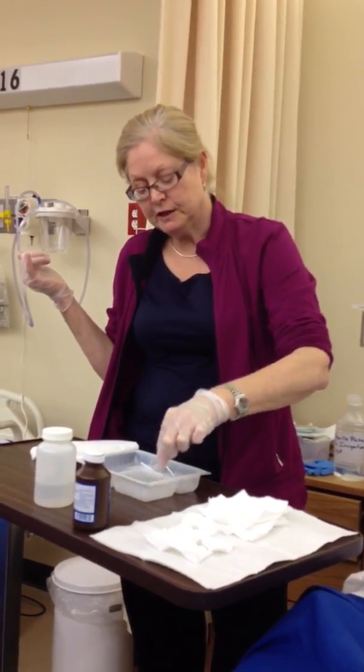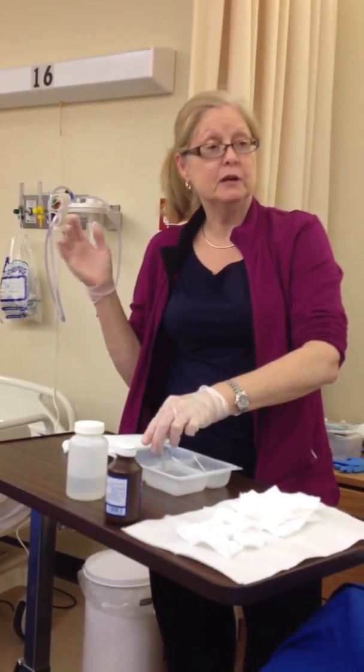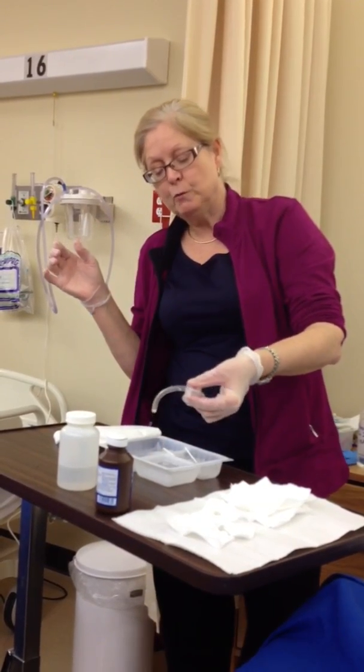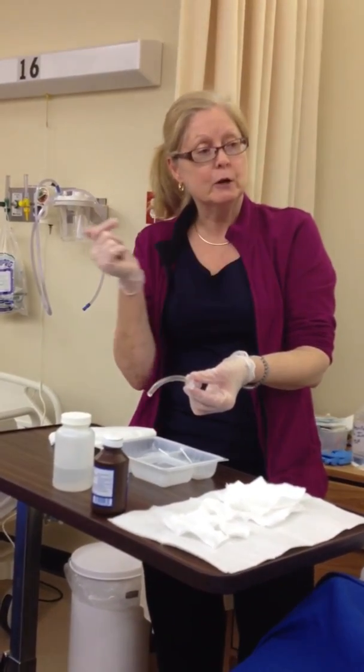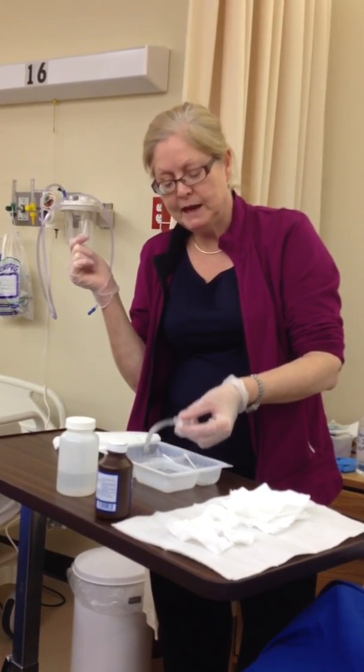I'm making sure that it really gets saturated, because has anybody ever used hydrogen peroxide? Yes, it's very caustic, so you can imagine putting it on a raw trach, that it bubbles up and would be very caustic. So we want to make sure too that there are no large molecules of water, because even one drop of water down his airway will cause him to aspirate. So make sure that we tap, tap, tap.